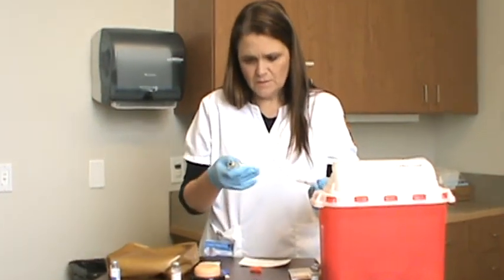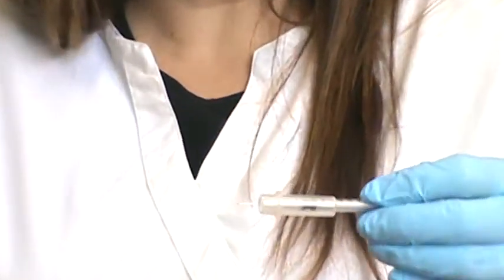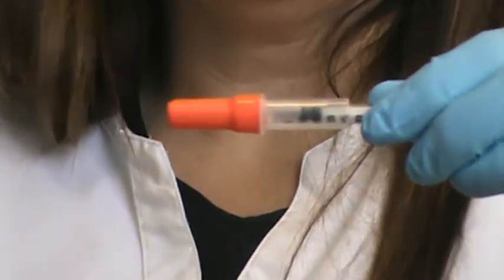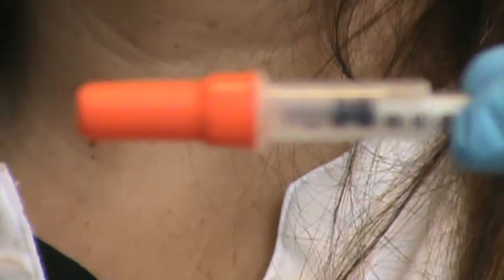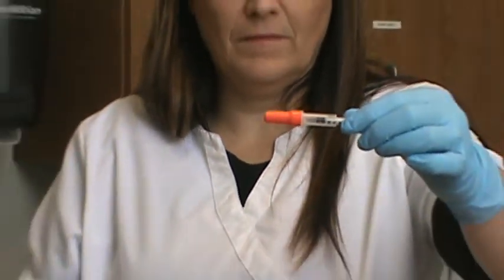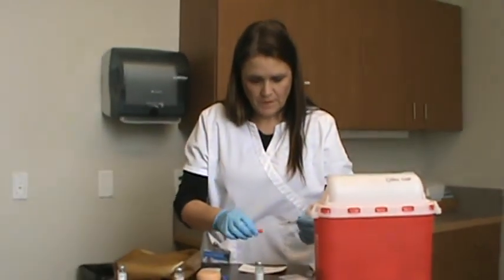Make sure that's still... Do you want me to zoom in? Oh, on it? Yeah, probably. Well, I'm making sure that's mixed. These are hard to see. Camera doesn't want to focus. That's at 9. Got it? Yeah, okay, it's good. Good as it can get.